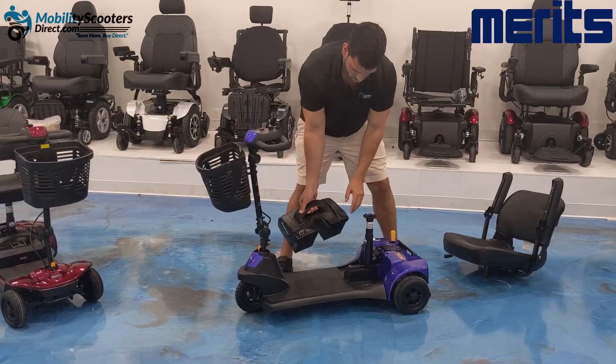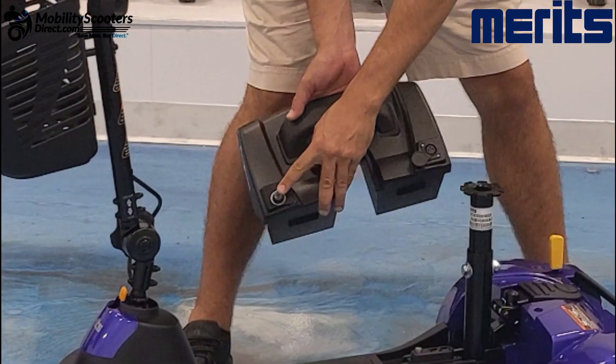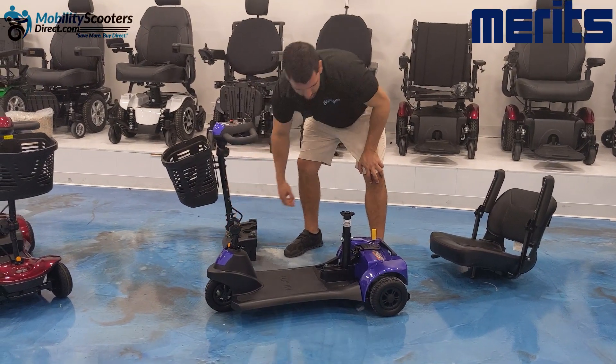There is a charging port on the battery box itself and a fuse trip button, so that in the event that you trip the fuse and the unit stops working, you can press that button and see if it turns back on.